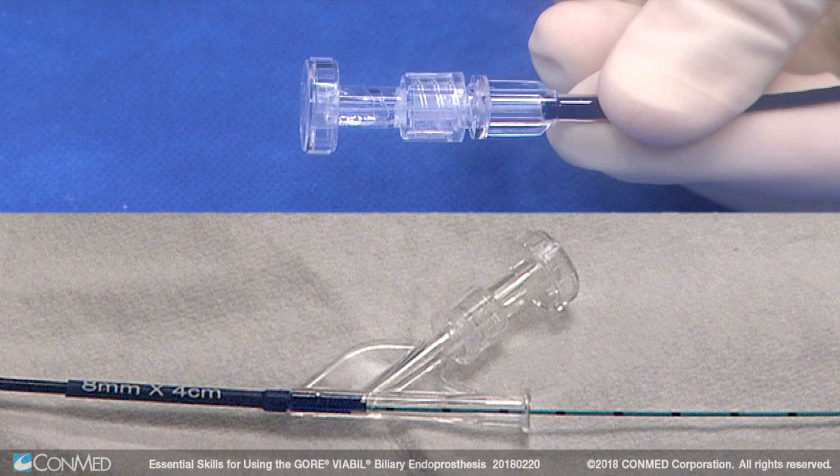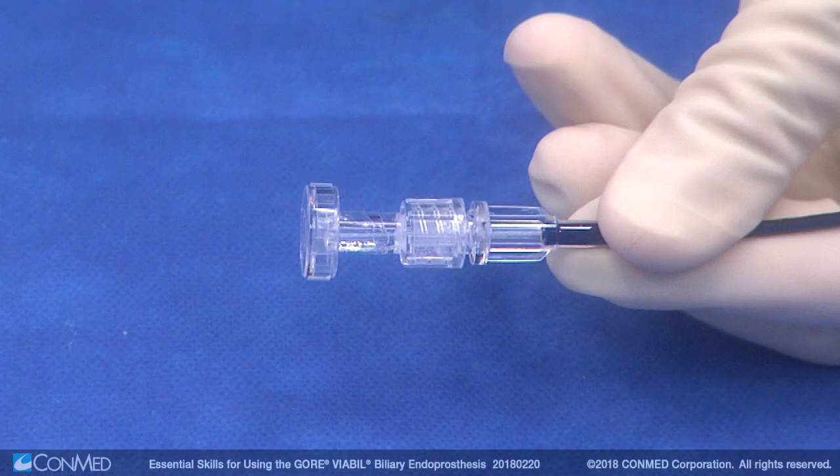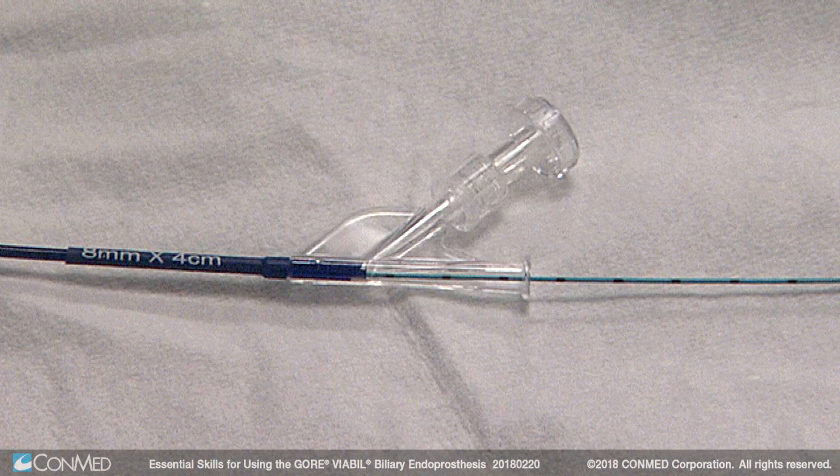The Gore Viable short wire biliary endoprosthesis only has one port on the proximal end, while the long wire version has two. One is for the guide wire exit.